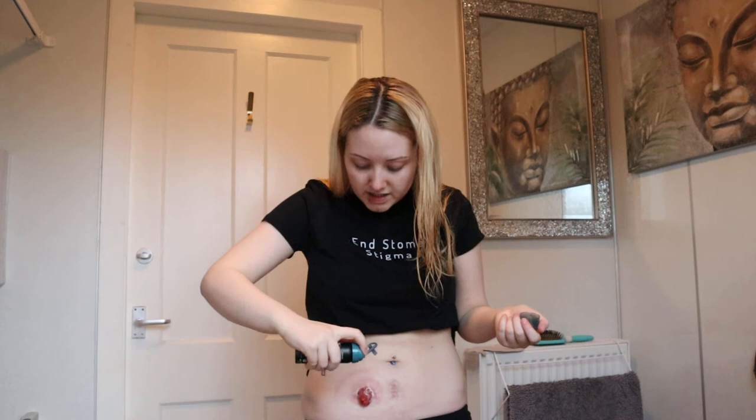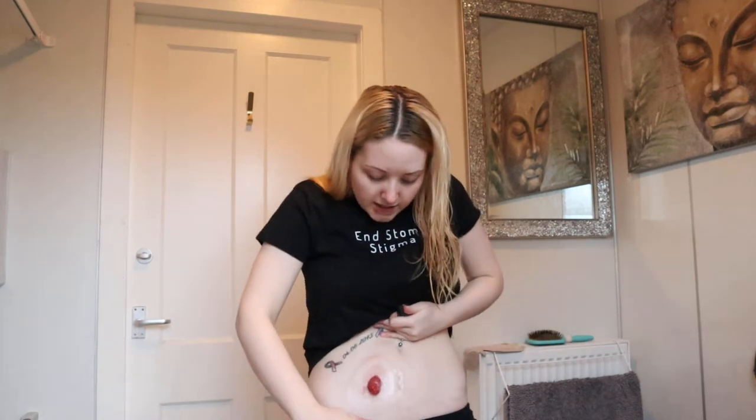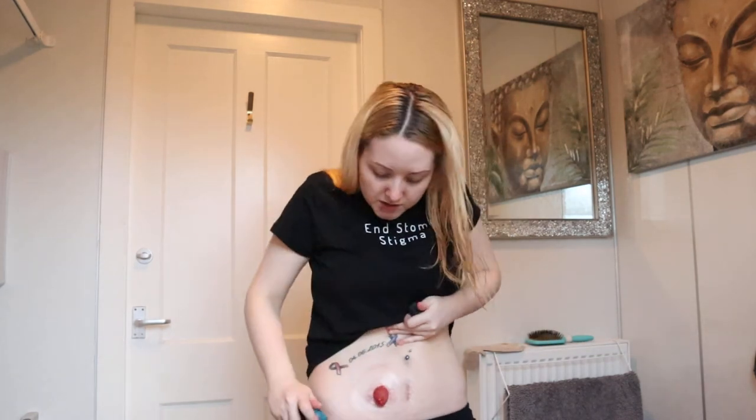And then next I'm going to go in again with my skin barrier spray. This is what's called the crusting effect. It enables the powder to still work but also protects your skin at the same time. When you put the skin barrier spray on top, it seals it so it has a chance to absorb all the moisture. It also helps your bag stick and prevents it from peeling off. So you just go in over all those areas that you've just dusted with the powder, and let that dry for a minute.